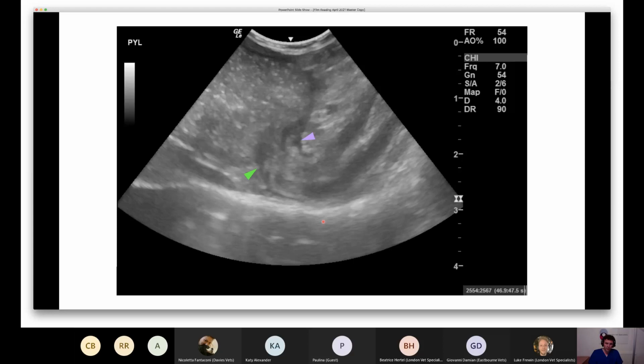So we did abdominal ultrasound. I think if you had taken some repeat plain radiographs, then what you would have seen is that stomach just gradually emptying, essentially, because the dog remained absolutely fine and clinically stable throughout, didn't really do any more vomiting, and I think went home maybe 12 hours, maybe 18 hours after those radiographs were taken.